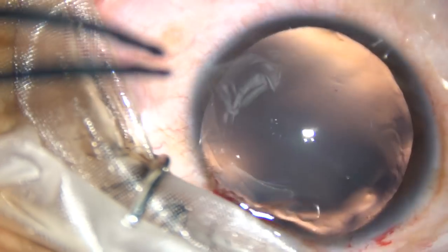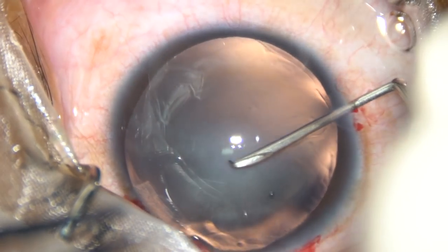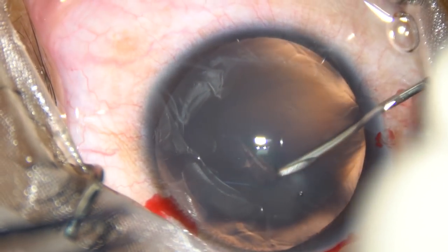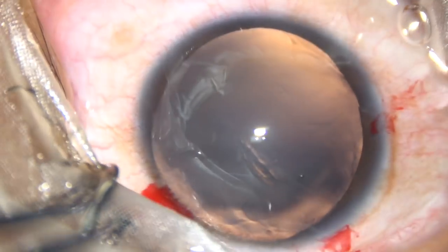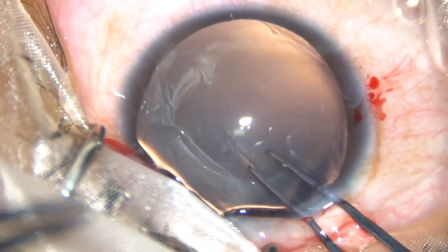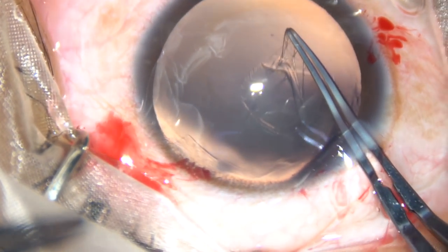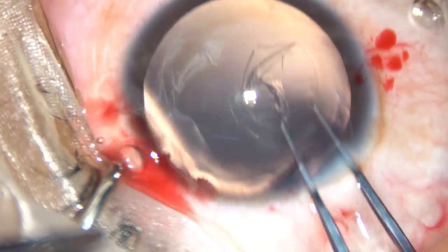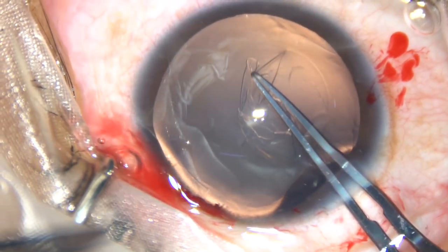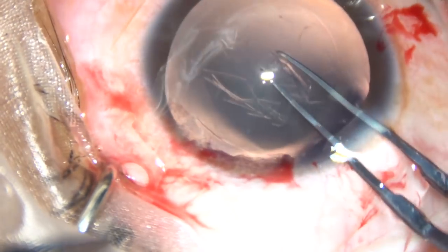And now, capsulorhexis. The anterior capsule is incised. A capsular tag is raised. Now I use a utrata forceps, hold this capsular tag, and in a very controlled way, I am going to do a rhexis of about 5.5 millimeters.